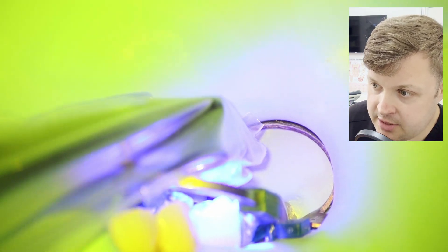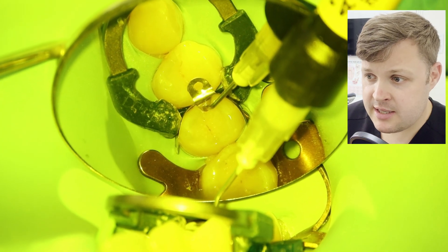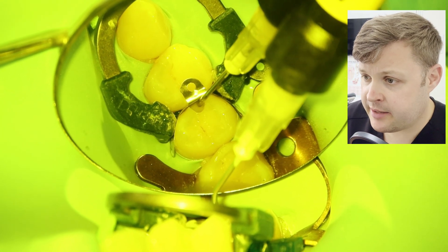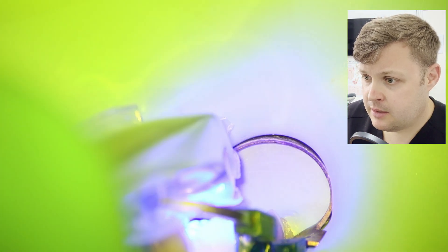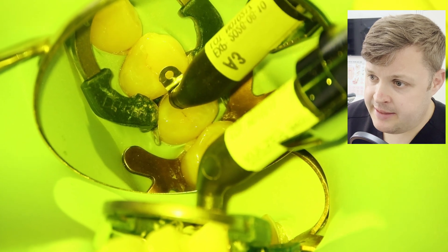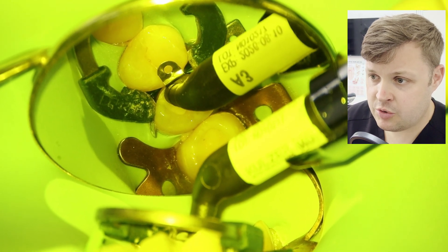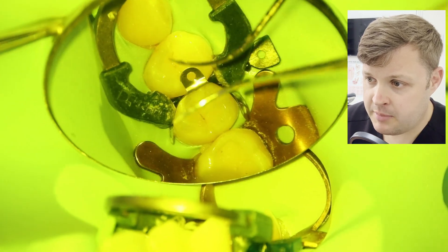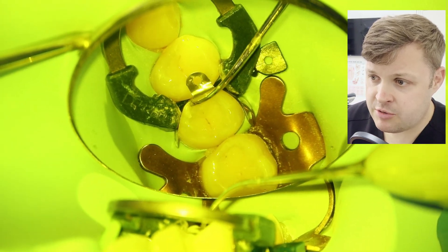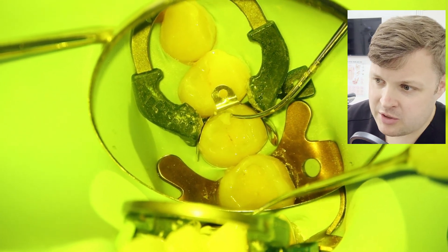We agitate the i-Bond into the cavity. In this case we're going to use flowable first — this flows nicely into the base of the cavity — then light cure, then use the capsule composite. Then it's just a case of using instruments to manipulate the composite.